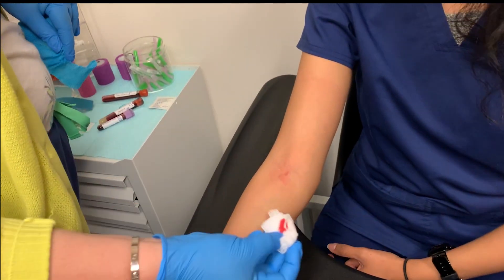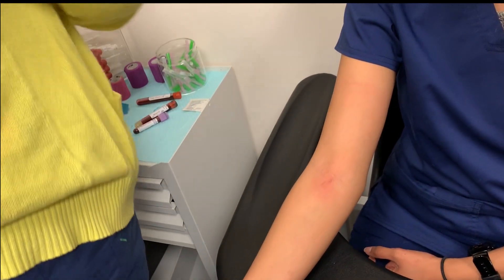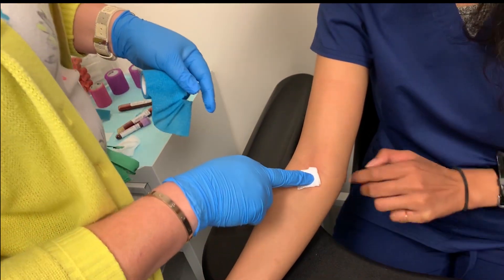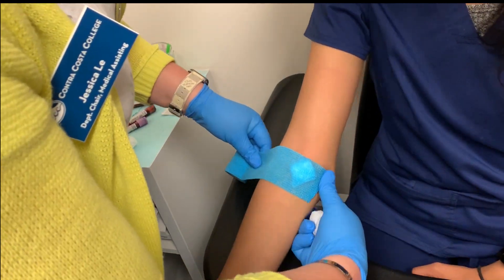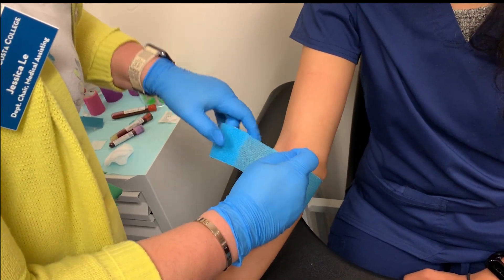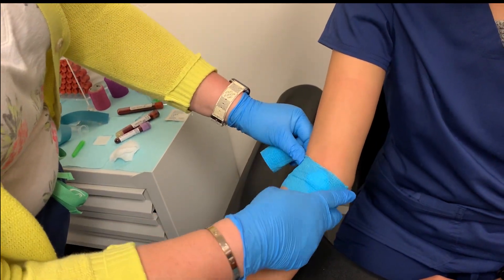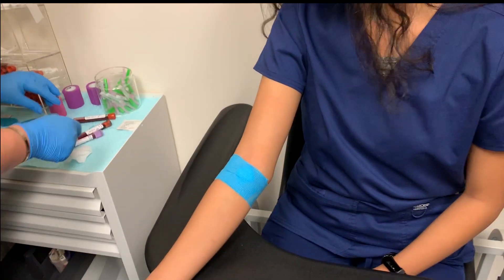I'm going to check and make sure she's doing okay. Looks like she's starting to clot there — I'll get some clean gauze. I like using Coban; band-aids, paper tape, and plastic tape all work just fine, but I like Coban because it's a good pressure bandage. Aftercare instructions: don't pick up anything heavy, don't carry a purse with this arm, and try not to bend your arm for 10 minutes or so.